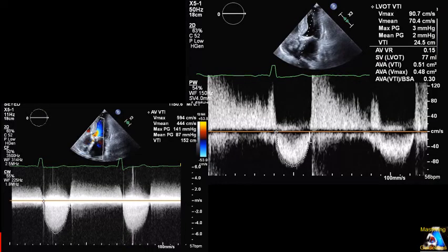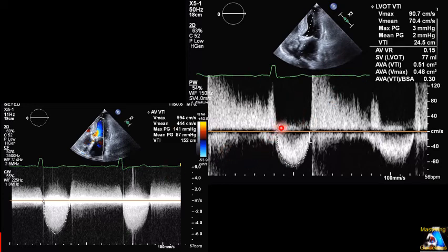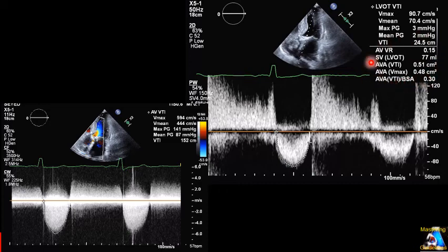Which Doppler and measurement is correct — this one or this one — and why? Now, if we assume our study is full and our measurements are correct, based on these two findings, what disorder does the patient have? Just based on these two Doppler measurements, what are those five parameters? What does each of them represent, and why? How do you interpret each of them?